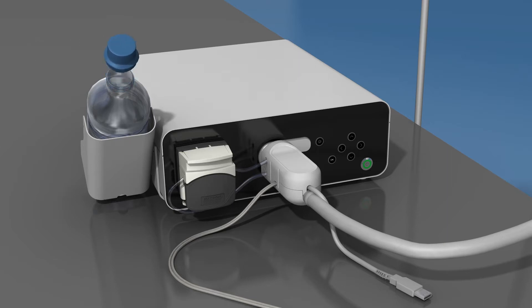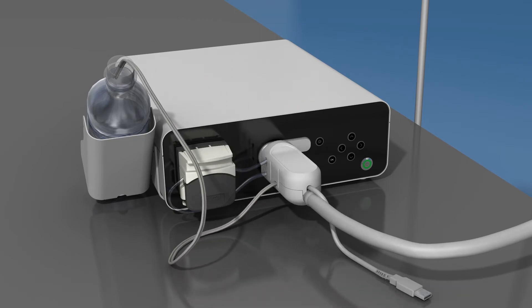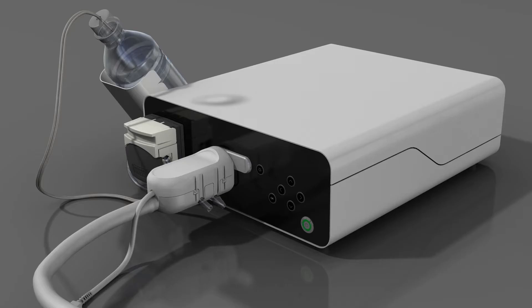Remove the seal and cap. Drop the water feeding tube directly into the bottle. The water feeding tube comes pre-connected to the endoscope. Ensure that the tubing end reaches to the bottom of the container. This ensures that the maximum volume of water can be extracted from the container during use.